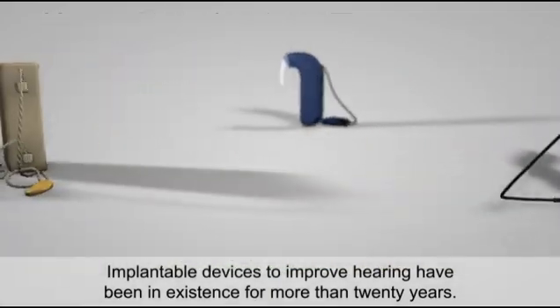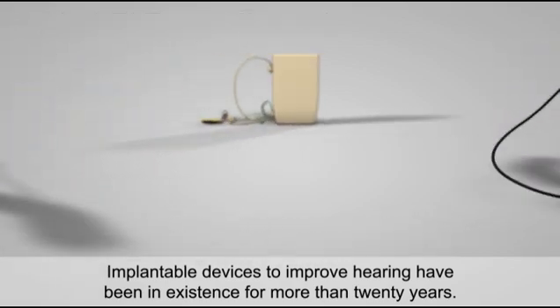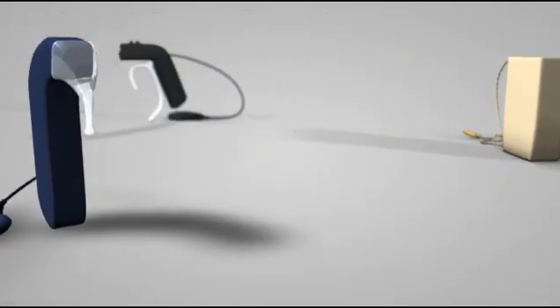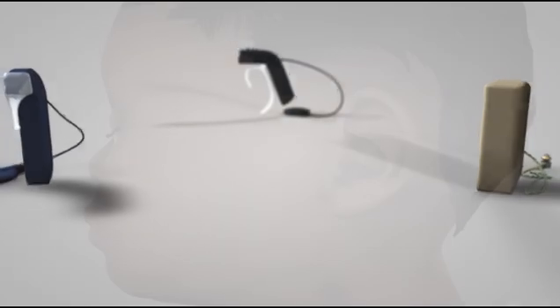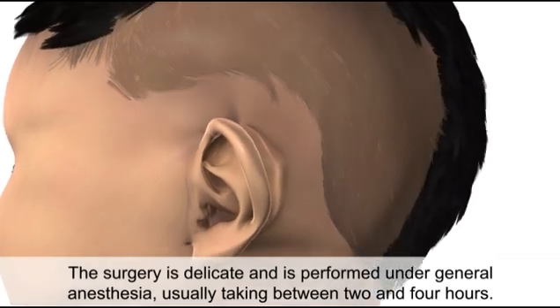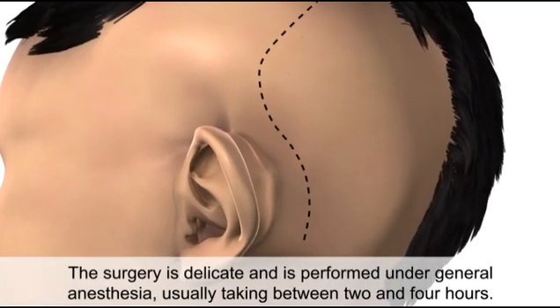Implantable devices to improve hearing have been in existence for more than 20 years. The surgery is delicate and is performed under general anesthesia, usually taking between two and four hours.